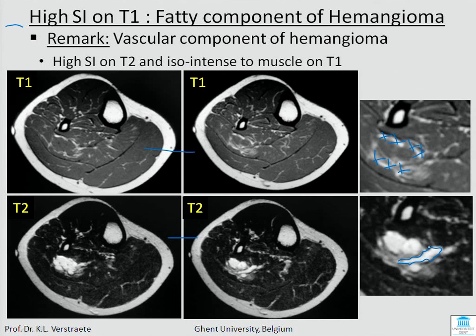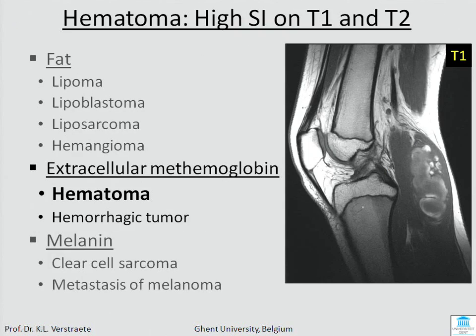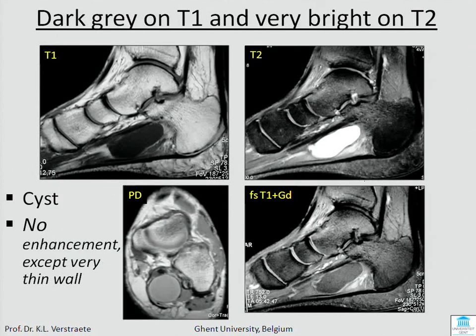This patient has a mass in the calf with high signal intensity at the periphery of the lesion and dark areas in the center. This is typical for a hematoma — the extracellular methemoglobin has high signal intensity on T1. Another easy one: low signal intensity on T1, very bright on T2, and with gadolinium you see only a little enhancement of a very thin wall. This is a cyst.